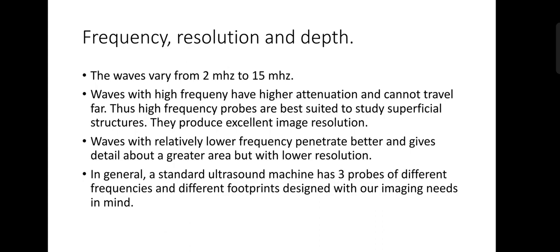The probes are defined by the frequency, resolution, and depth. The waves which they transmit vary from 2 to 15 MHz. Waves with high frequency have higher attenuation and cannot travel far. Thus, high frequency probes are best suited to study superficial structures. They produce excellent image resolution. Waves with relatively lower frequencies penetrate better and give detail about a greater area but with lower resolution.